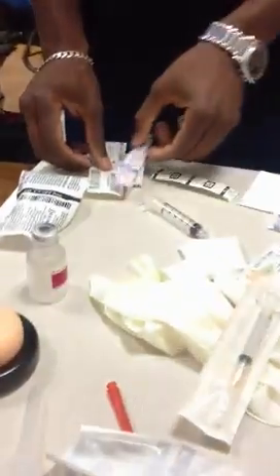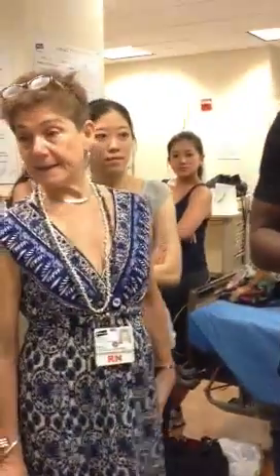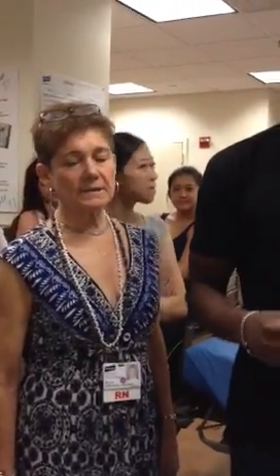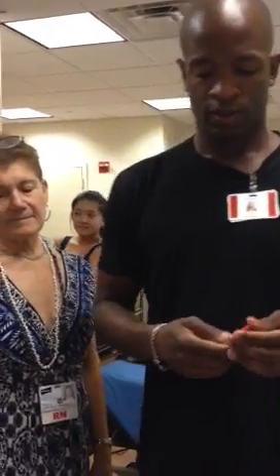All right. So I'm going to grab all my equipment at this point. I have my 3 mil, my alcohol swab, and my blunt needle. So start withdrawing the meds. Now, sometimes you can also have a Band-Aid in case they have a little bleeding. There are no Band-Aids? I didn't see any. I couldn't find one. So we need to put some out. We can have the pudding ones, I think they're Batman.